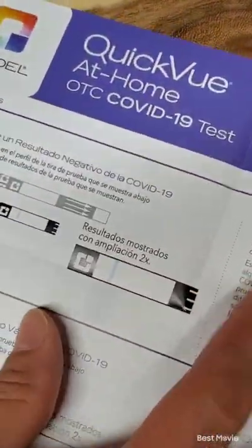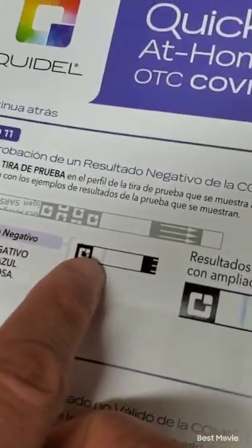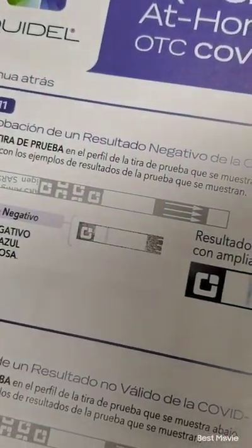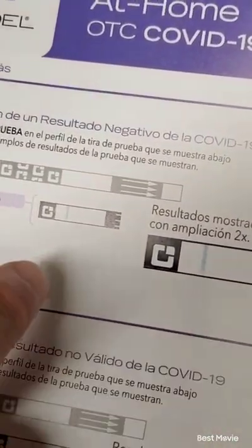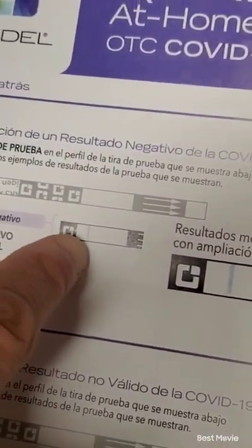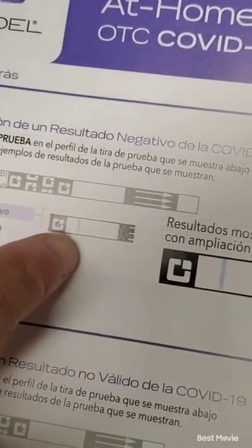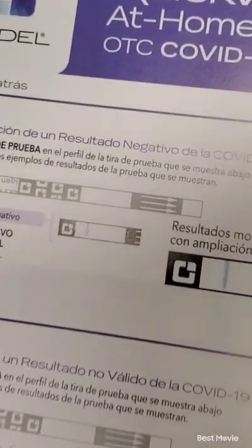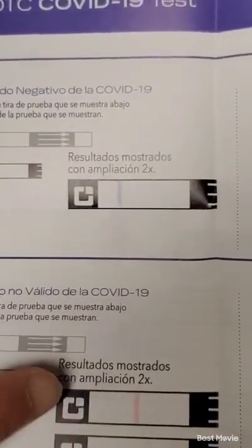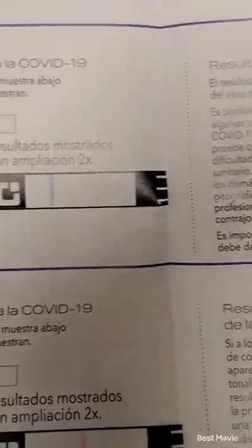Now a negative test would just show a blue line. I understand this is in Spanish — I don't know what happened to the English instructions — but it's pretty much the same thing. The negative test is just one blue line, no faint pink, nothing. Now if there's a faint pink line by itself and no blue line, that means it's an invalid test, so you have to take it again.